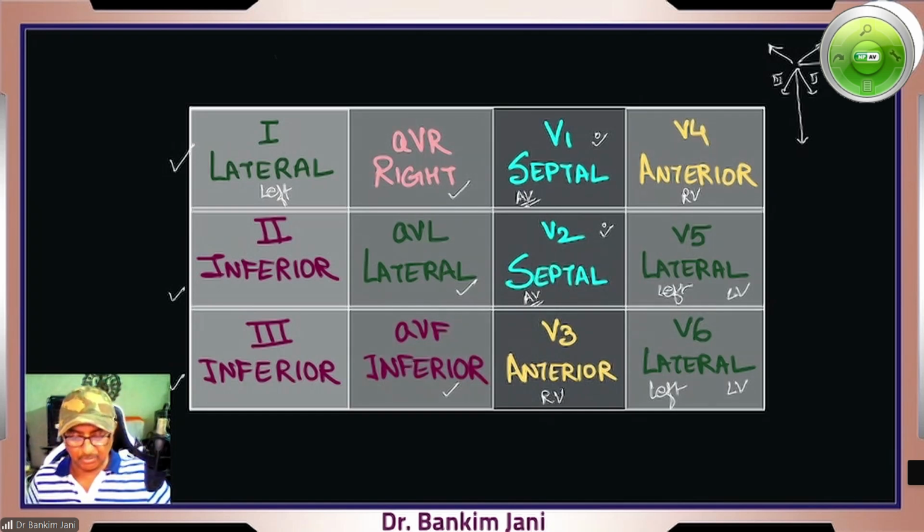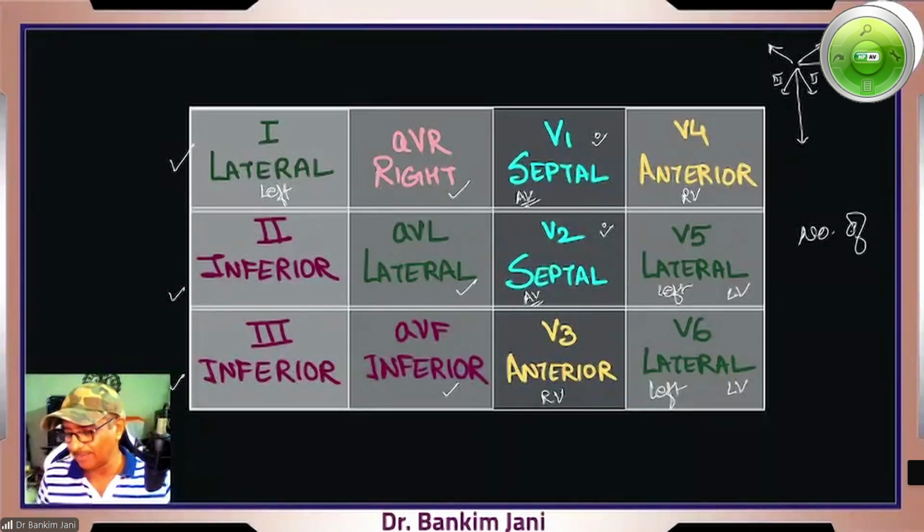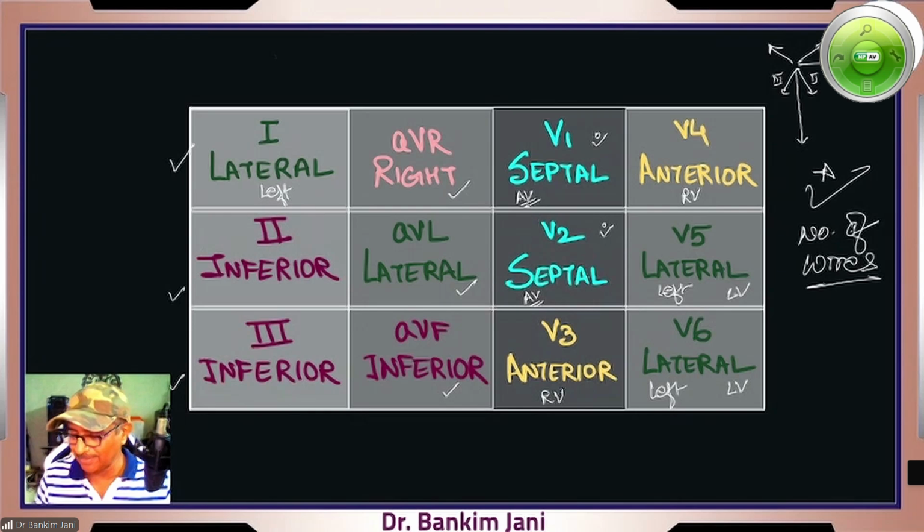So in total, how many wires are there? How many wires are connected from the ECG machine to the patient? Number of wires are, because this was one of the questions.